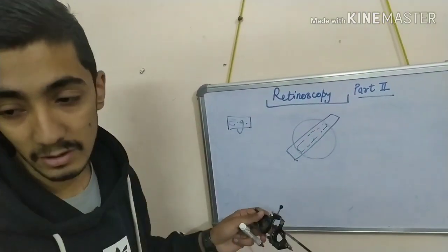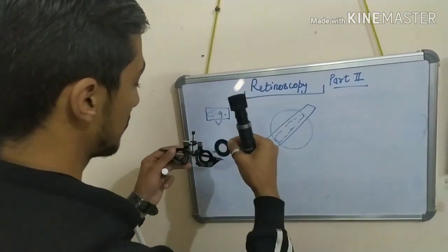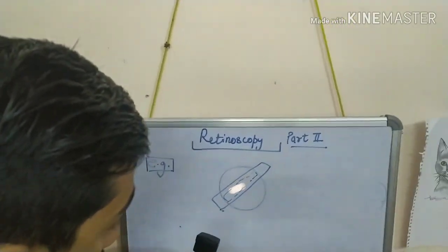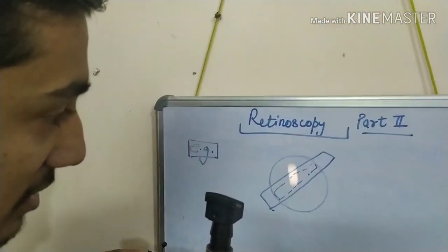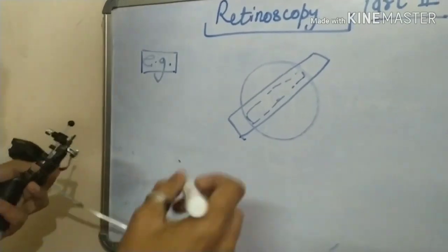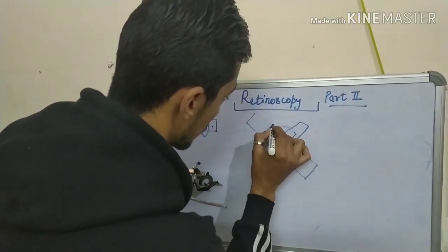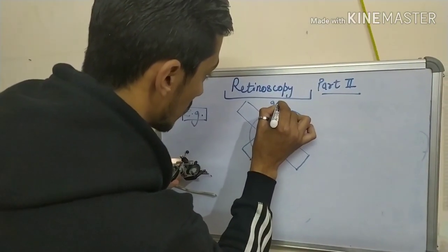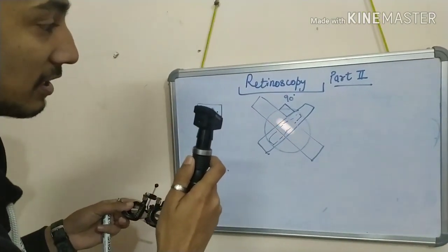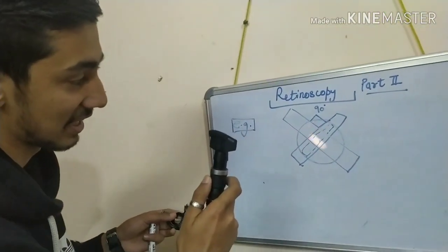Now you neutralize. For example, this meridian is neutralized with the sphere — for example, plus 3.75. You put plus 3.75 in the trial frame and neutralize in this meridian. Now you have to rotate the slit 90 degrees apart. This is the slit at 90 degrees apart at this meridian. For example, at this meridian, you move the slit 90 degrees apart. Now you have to neutralize in this meridian with the cylindrical power. For example, here the movement is against movement. You find the against movement here and neutralize it with the cylinder.